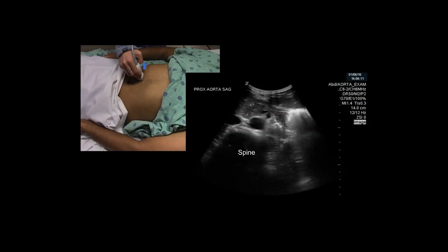In this clip, you will see two large vessels superficial to the spine. The aorta can be seen on the right, which is on the patient's left, and the IVC on the left, which is on the patient's right. Imagine that you are looking up at the vessels from the patient's feet, like a CT scan.